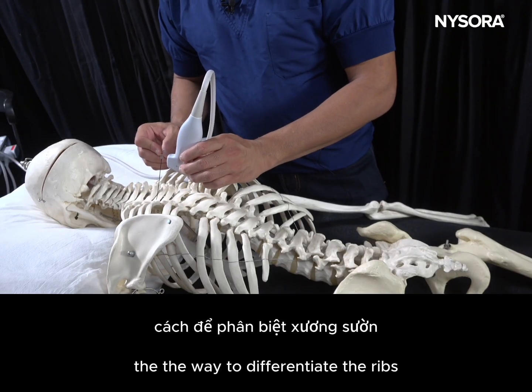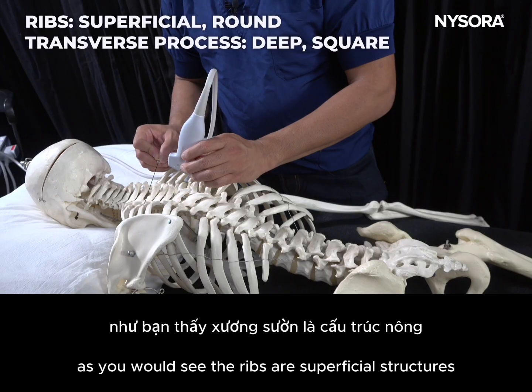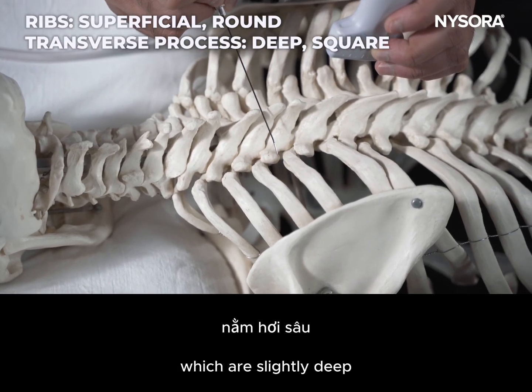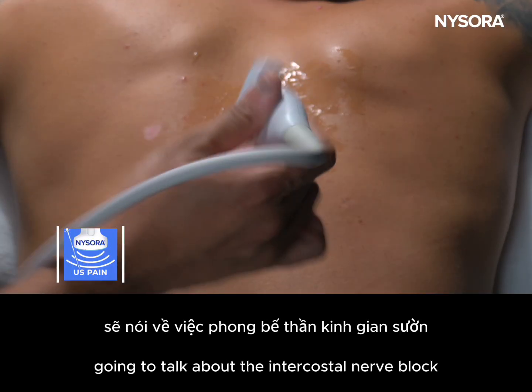The way to differentiate the ribs and the transverse process is that the ribs are superficial structures and they also have a round appearance, as compared to the transverse processes, which are slightly deeper and have a square-shaped appearance on the ultrasound. We're going to talk about the intercostal nerve block.